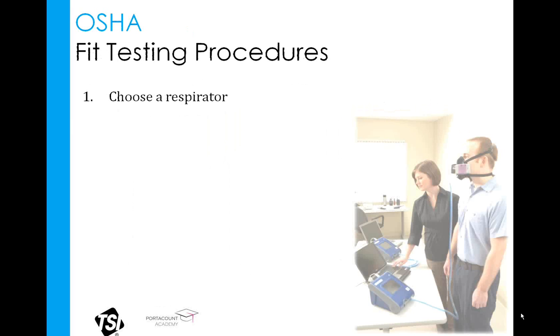Now here are the prescribed steps to fit testing according to the OSHA standard. There are 14 steps in all, and the last step, 14, being the actual fit test. If you're following a different standard, I think that you'll find that though they may not be exactly matched up, the process is roughly the same no matter which standard you're referencing. The first step is pretty obvious. You're going to have to choose a respirator to wear.